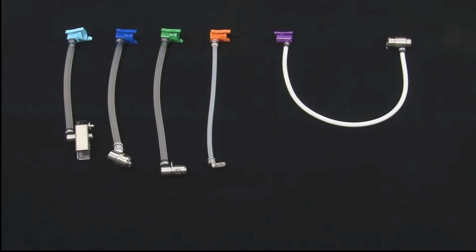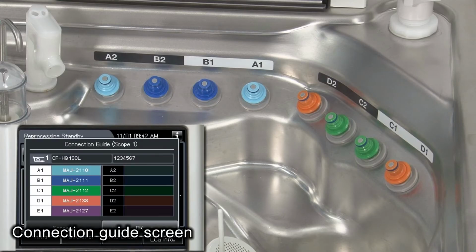Now connect the connecting tube to the scopes. If you activate the connection guide setting, after your scope ID is recognized through RFID, a connection guide screen provides the information about the type of connecting tubes required for the endoscope, as well as the location of the connectors that these connecting tubes are connected to.